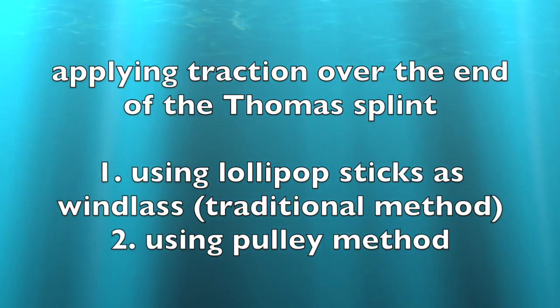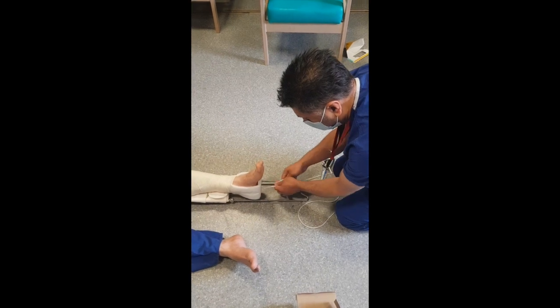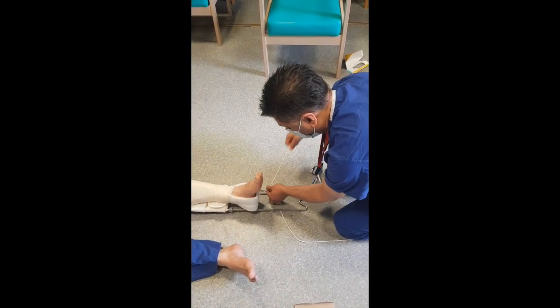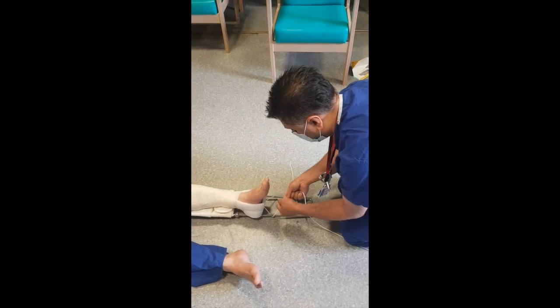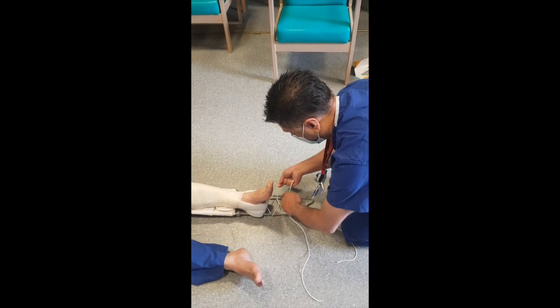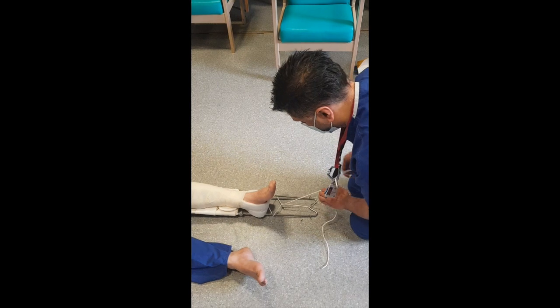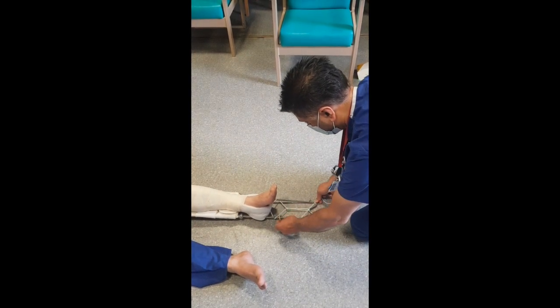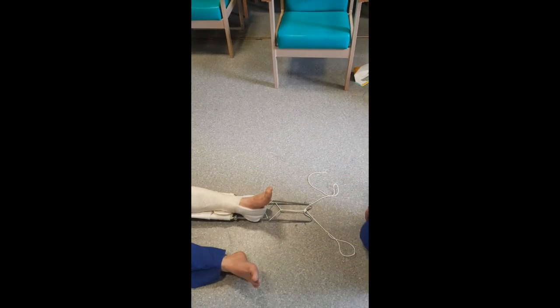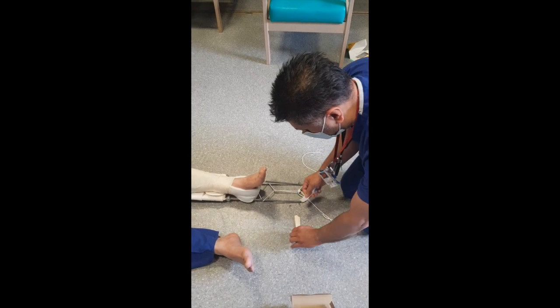I'm going to demonstrate applying traction to the cords at the end of a Thomas splint using a traditional windlass method and a pulley method. Using the traditional windlass method, you need to take hold of the cords — the inner cord goes underneath the Thomas splint and the outer, most lateral cord is going to go over the top of the splint. Pull them back together in the middle and tie a little knot. The cords then go over the end of the splint, form a loop, and then tie a knot again. This will give you a little bit of traction. We're going to get hold of some lollipop sticks — you'll often need three — and these need to be tied together so that they don't splinter while they're being used as a windlass.